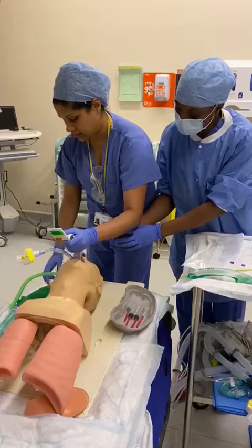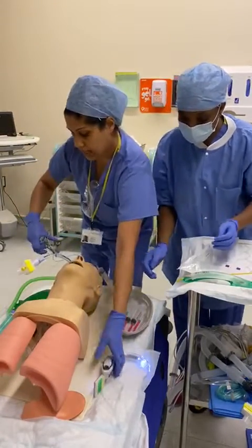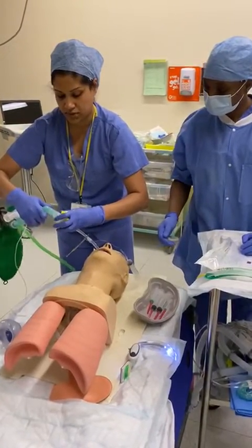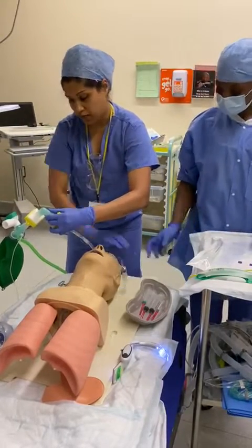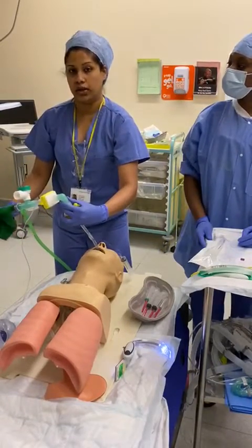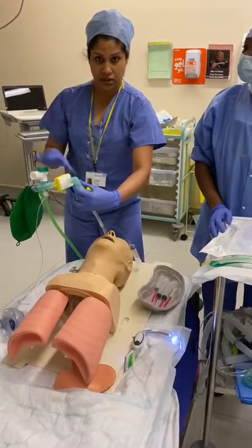And in the meantime, apply the clamp, McGrath out, oxygen supply off the mask onto the filter, clamp off, make sure the cuff is up, and then you bag the patient. And it has to happen in that order. You're not going to bag the patient when they're getting off to sleep.